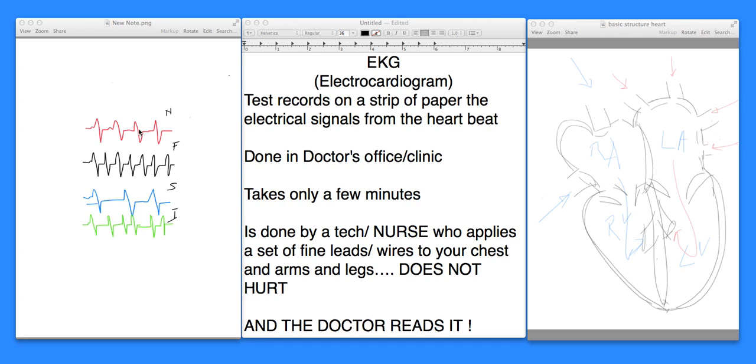Now, a normal paced heart, as I said, runs about 70 to 80 per minute. Now look at this. This is the second example where the heart is beating more rapidly. Beat, beat, beat, beat, beat, beat, beat. You see that? So that's a fast heart pace. And here the heartbeats are about 110, 120 per minute. As you see, it's faster than the strip above. Then you have the third strip.